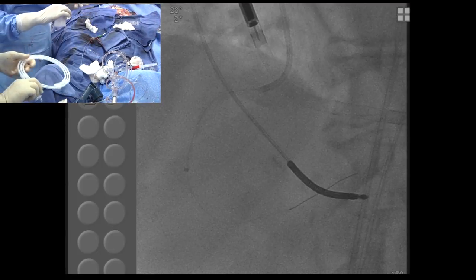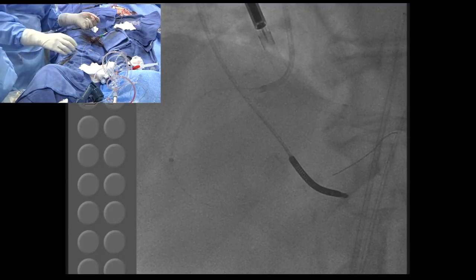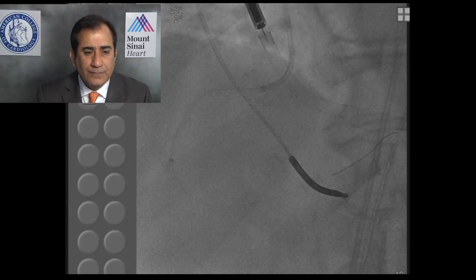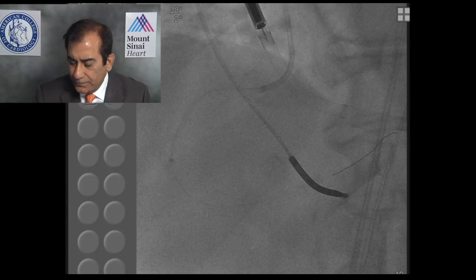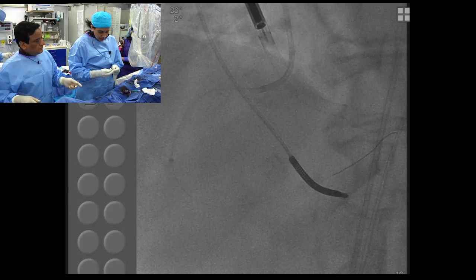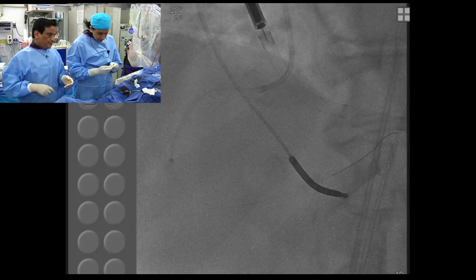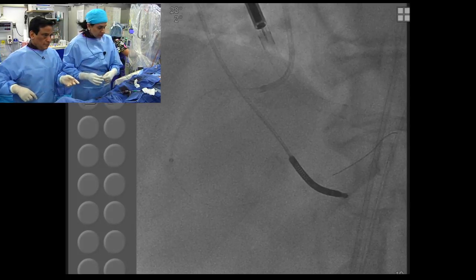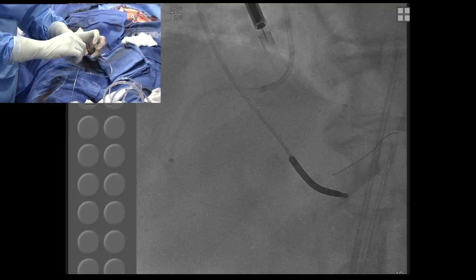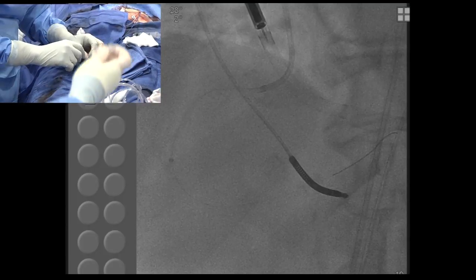Average flow now, I was told, is 3.2 with the Impella. How long are you leaving the Impella in? In all our cases we have removed it post-procedure in the lab. Once we deploy the stent and everything is good, they start automatically, irrespective of the ACT, because you have the pre-close there? Pre-close, yes. It's a 3.5, 38 Promus Element, a real test of the stent.